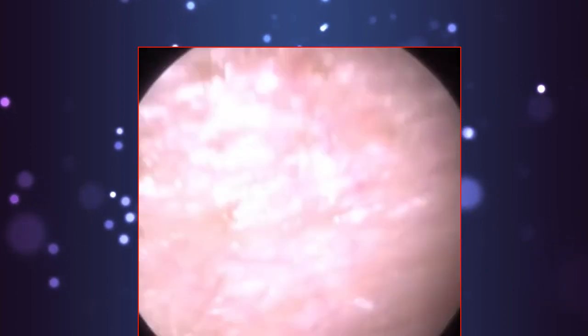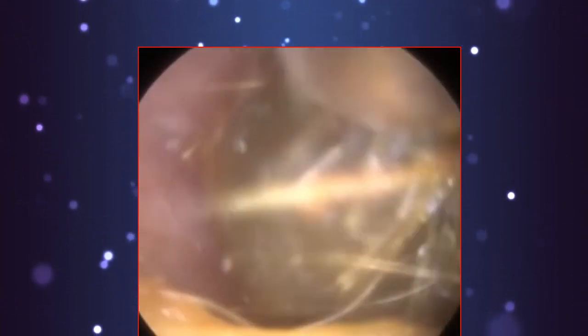The entrance of the ear canals, at least the left one, and also when we do the right procedure, you'll see that it's got loads of hairs there. It's quite a lot of hair, almost like whiskers. And another slight issue is that some of these hairs have become loose.